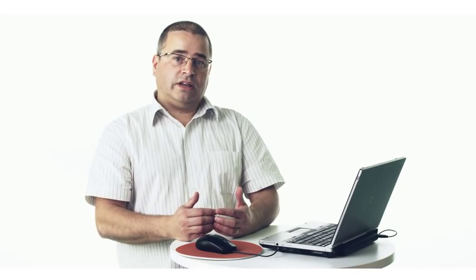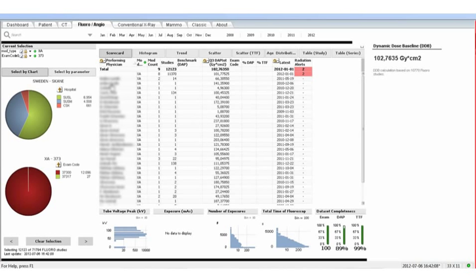Another key area of functionality offered by the DoseTrack system is the ability to compare radiographers performing the same procedures on the same cohort of patients to identify at a very early stage whether any training needs are required. As you can see, the radiographers are listed on the left-hand side of the screen and their average doses are listed in the center of the screen.